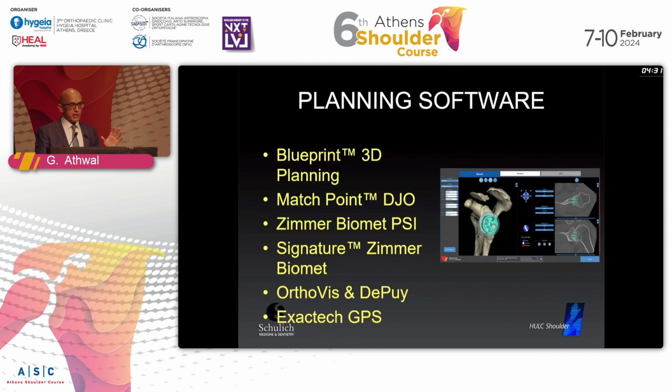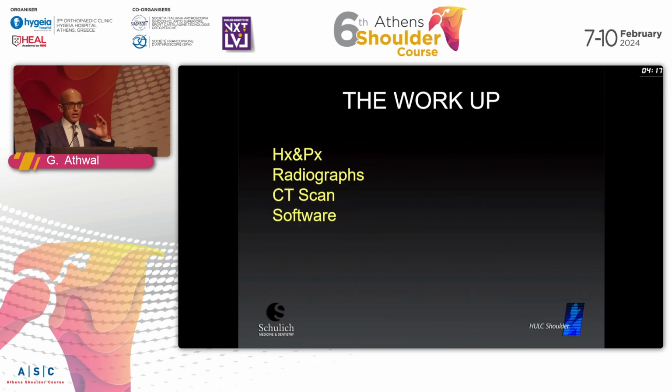There are many different types of planning software out there. I think all of them have their pros and cons. There's no one planning software that's better than the other. I think it's really important just to identify which one you like or which company you choose to work with. So in the process, before we get to preoperative planning, we always do the history and physical examination, we get x-rays and a CT scan, and then I put them through the software.